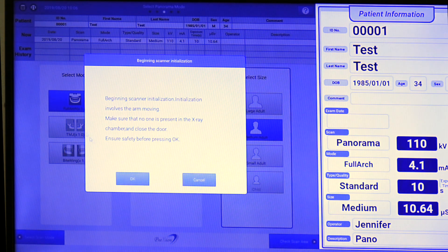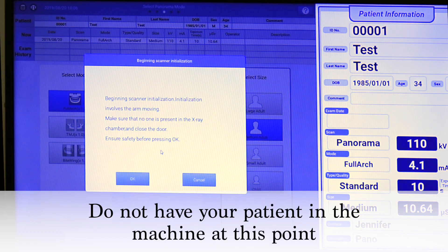Click OK. The initialization will then begin. Please make sure no one is near the scanner, as the gantry will rotate.